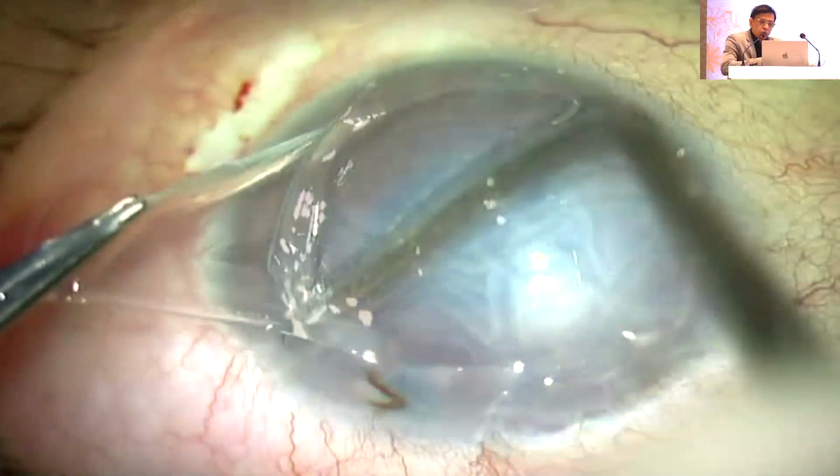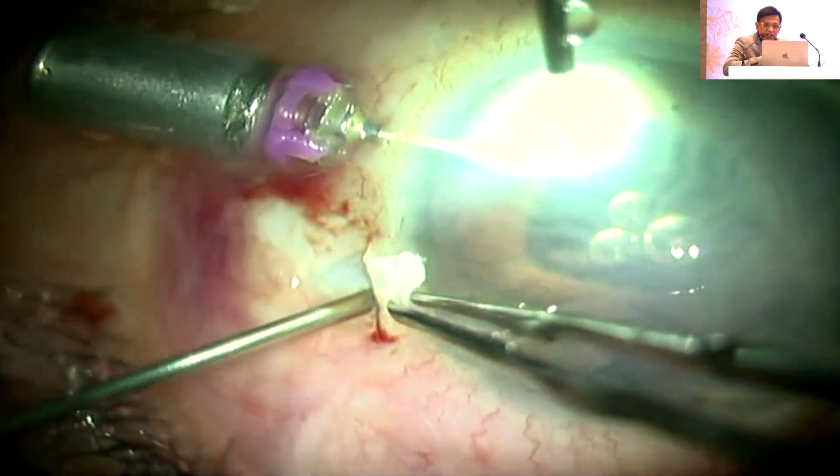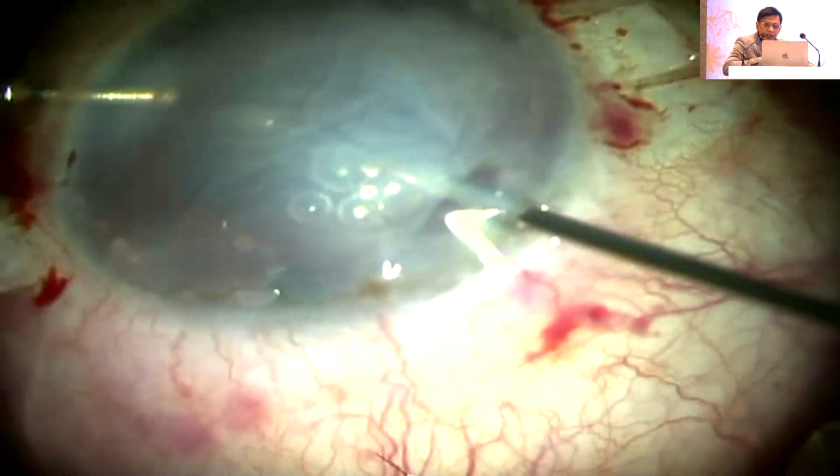This was another case who had been referred to me by Dr. Natarajan. This patient had been operated 6 times, see the scarred cornea, had gone in for routine cataract surgery only, and had got complicated elsewhere. Now look at the scar, it's so bad.